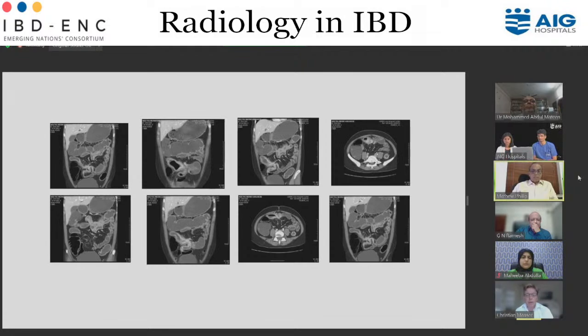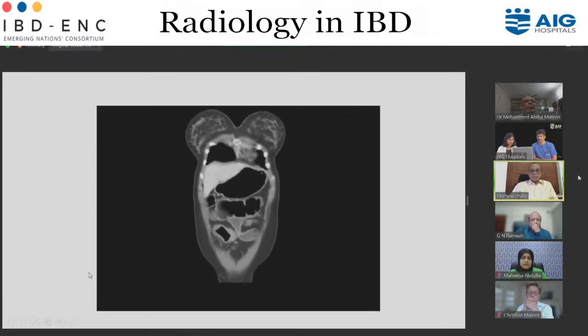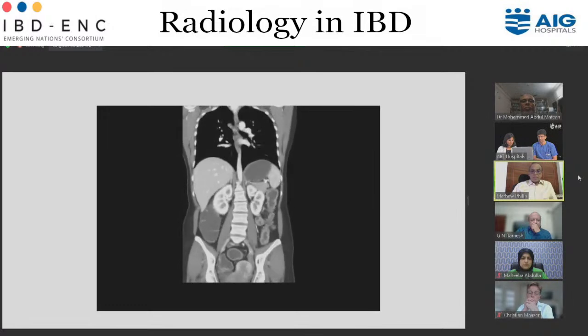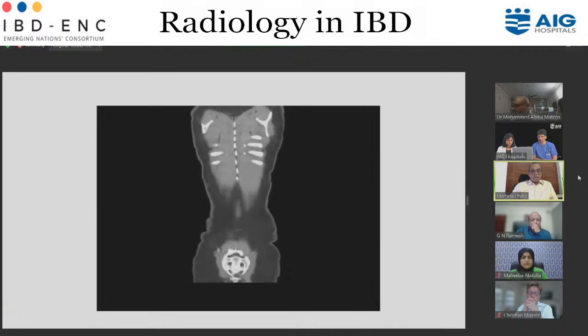Can I have the next slide? That's a video of the image. So we have decided to go for, can I show that? This is just to show that the radiologist knows how bad it is. And we have actually advised, you can see even the tablets are lying in the dilated bowels. There is a critical stenosis. Next slide.